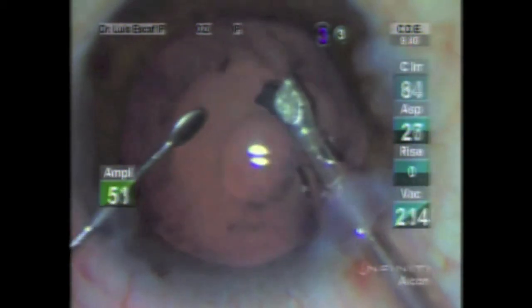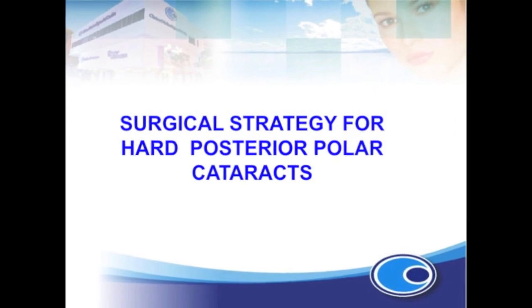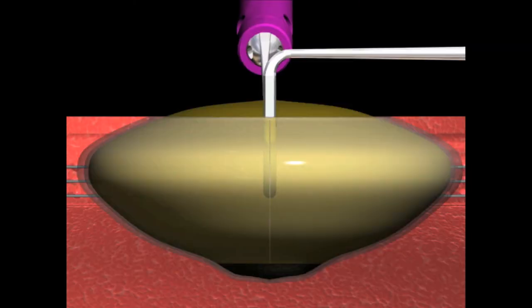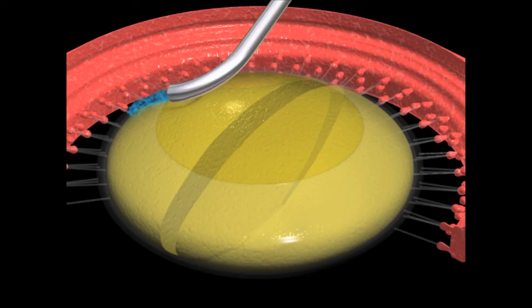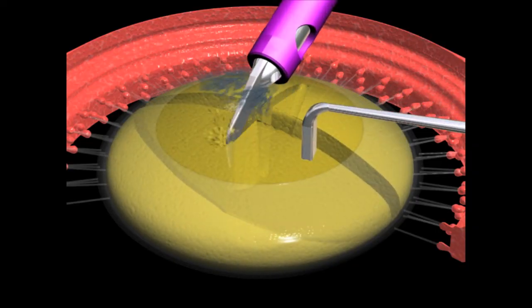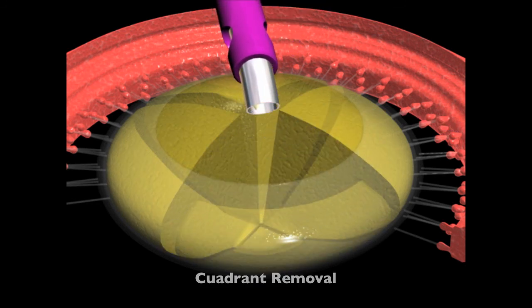In cases of hard posterior polar cataracts, after making the capsulorexis, we proceed to fracture the nucleus into two halves with the ultra-chopper, preserving the posterior plate. Then we proceed with hydrodissection and we can see how the fluid surrounds the posterior plate without lifting it. We continue with fragmentation into four pieces and phaco the distal portions of the quadrants to reduce the thickness of the cataract. We then move on to visco-dissection to gently detach the plate.